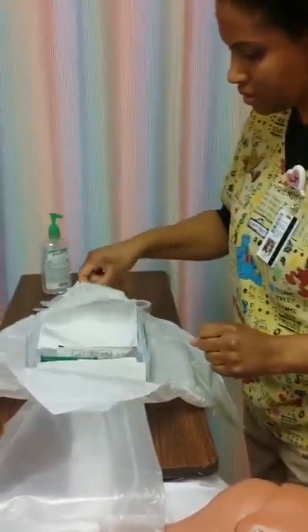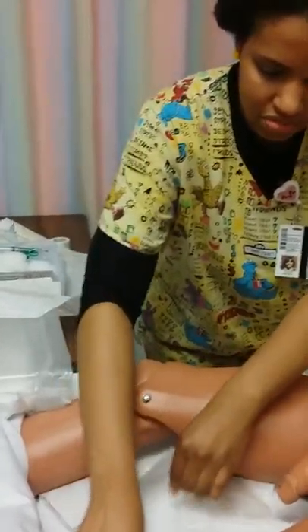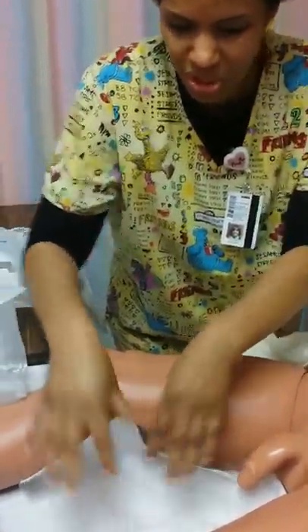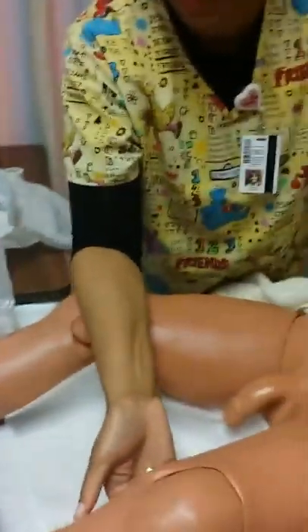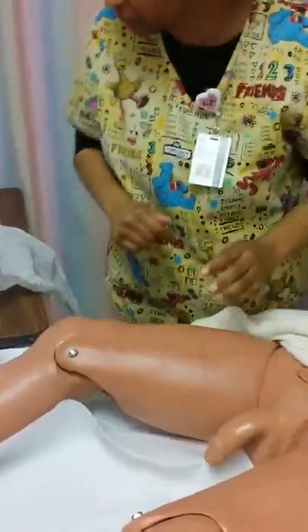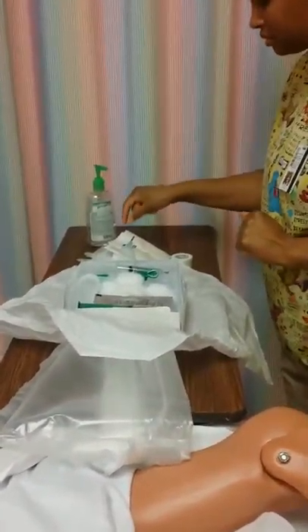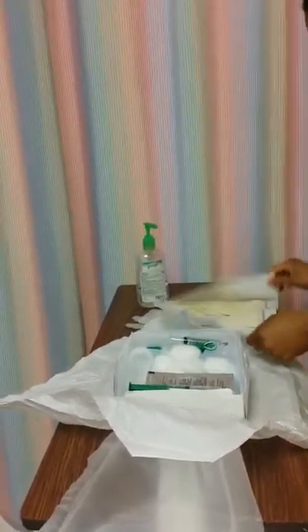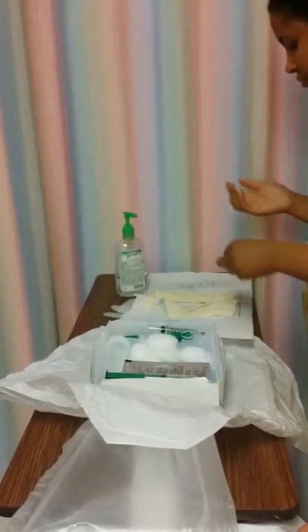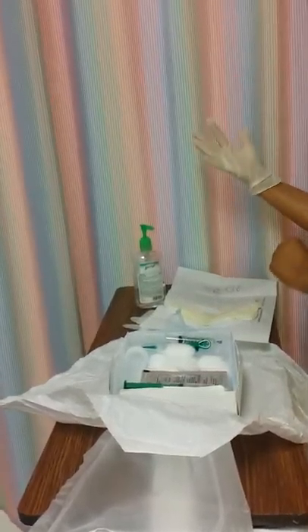Okay. And then put this down and put it up under there, still providing a sterile field, so that iodine won't be messy. Positioning my patient's legs a little spread open so I can reach everything, okay? And I'm going to wash my hands again. And I'm going to open my gloves up, thumbs out, starting with my dominant hand, and holding the gloves so I don't contaminate them.